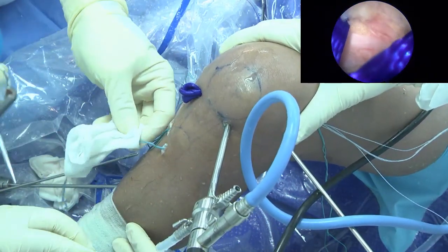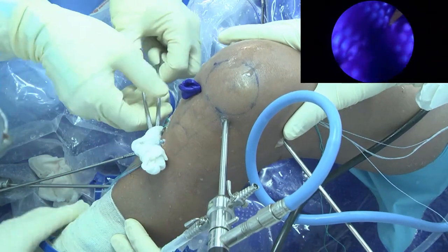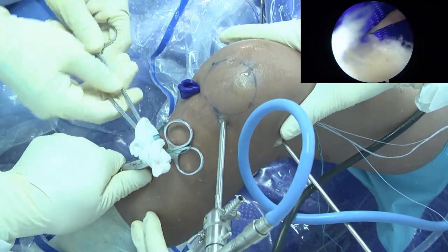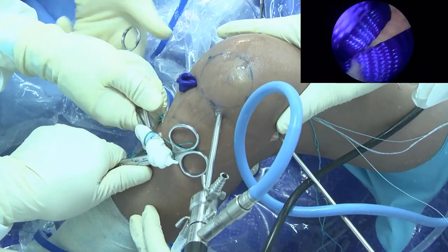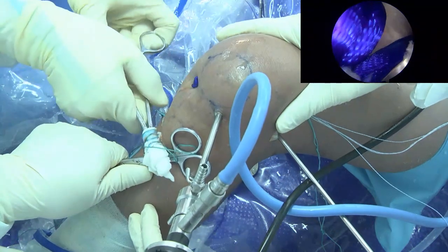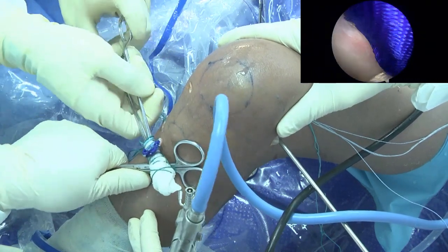So the way we pull, we turn. Yeah, we put it this way. You look at this, right? And then we slowly turn. Yeah, that would be better. Roll it down like this, and you put something to protect the skin, blocking the skin. Turn. Okay, good. Coming. It's coming. It will go slowly, right? Like you are turning the fillet, getting it out. In. Very good.